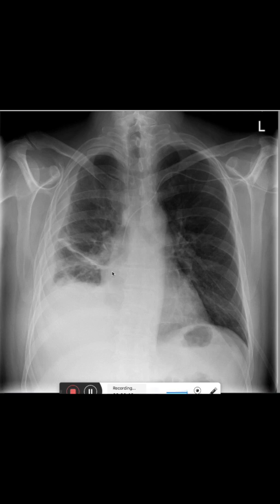We also see here this white line in the right middle field. This is a discoid atelectasis, so an area of lung that does not get enough ventilation.